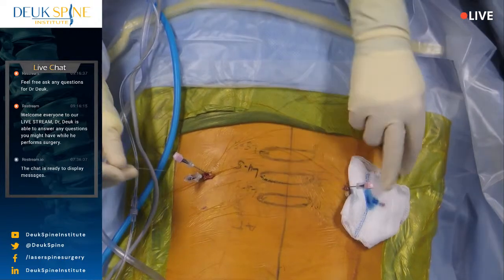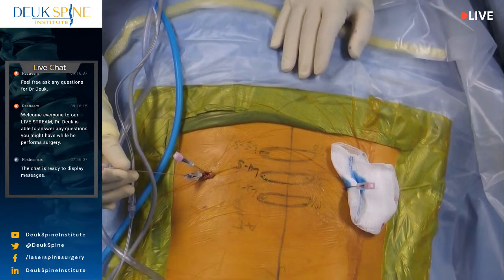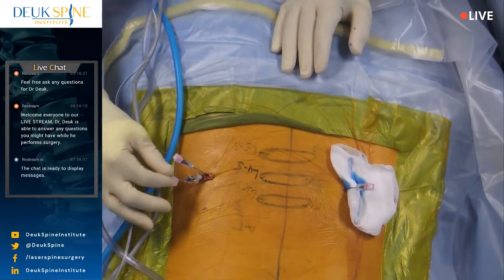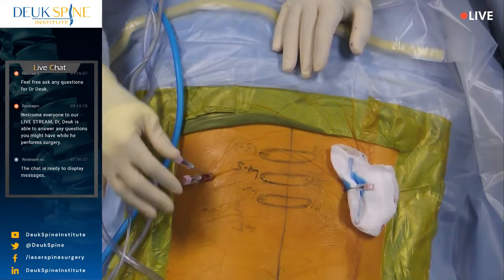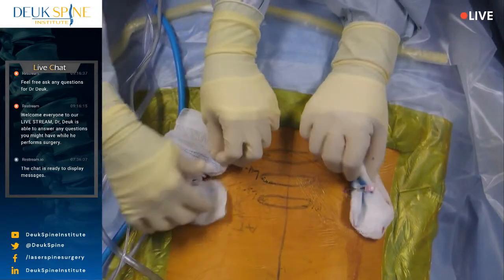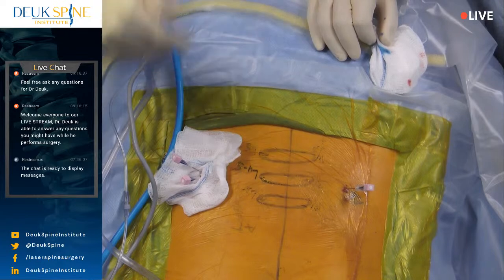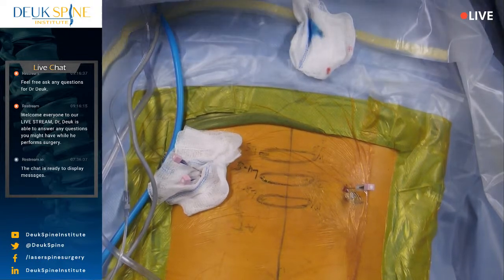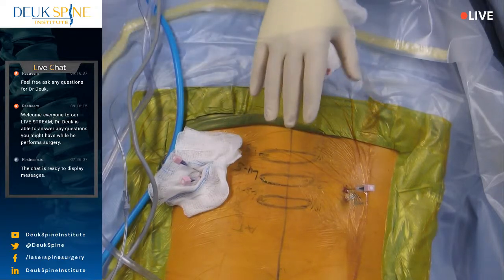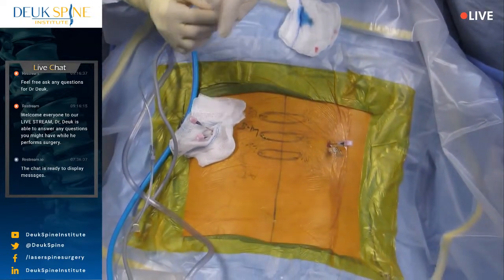We use propofol. Of course, the patient's not intubated. They don't have a tube down their throat because we need to talk to the patient during the surgery, like right now, what you saw. But also, there's no need to put the patient under general anesthesia for this type of procedure. It doesn't require it, so there's no real advantage to doing it. Our patients get what's called twilight sedation for the lower back and for thoracic disc herniations. Now, this surgery can be done for thoracic herniations as well if people have painful thoracic disc herniations.